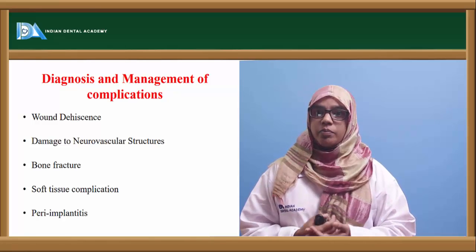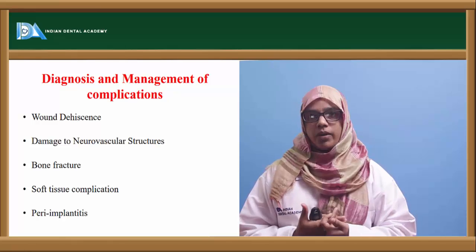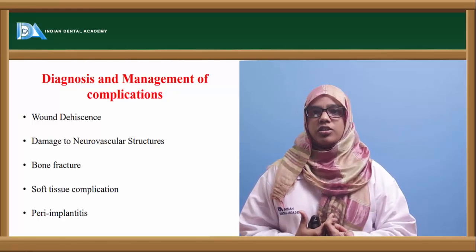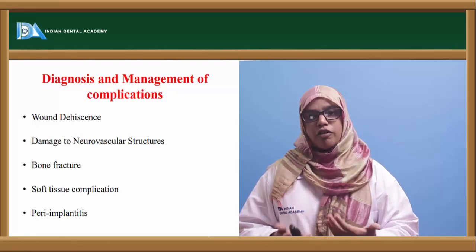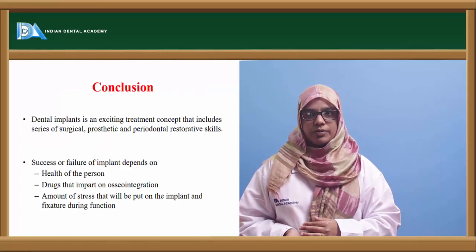There are chances that peri-implantitis can occur. It is nothing but inflammation around the implant. What you need to do is, do not panic, do a thorough curettage in that area. If required, you could use a diode laser at the peri-implant area. Eventual healing can take place and you can go ahead with the loading procedures.